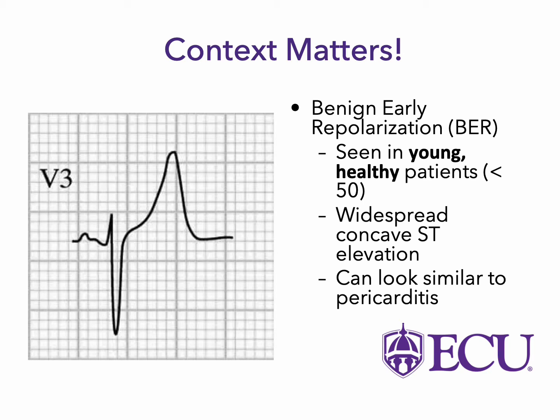We'll see widespread, what we call concave ST elevation. So what does that mean? Concave meaning that this is kind of curving up like this, right? It isn't that tombstone that we typically associate with that ST elevation. This is more concave, so going up like this. And this can look similar to pericarditis, right? Diffuse ST elevation can look like pericarditis, and that can be a little bit confusing.